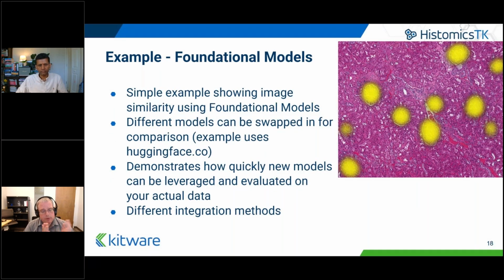The other thing, and I'll show an actual live demo of this, recently there's been a lot of growth in an area called foundational models. So this is our latest machine learning technique, where you have a process where you show it a large number of labeled images, and you can say, hey, I now have learned this, but hopefully I've learned things that I didn't know I was teaching it. The goal here is to have a basis on which you can build custom models, or maybe the foundational model is enough to answer your questions directly.